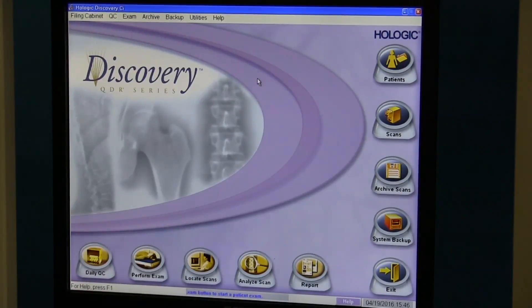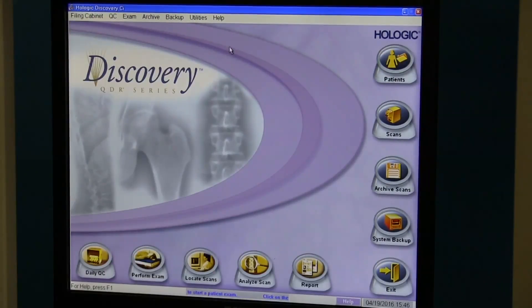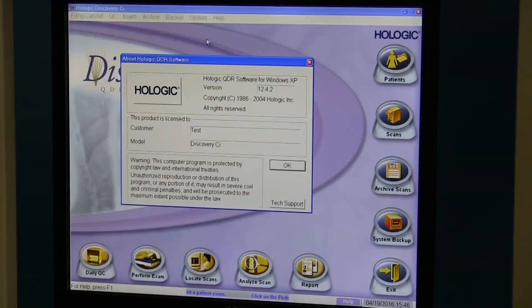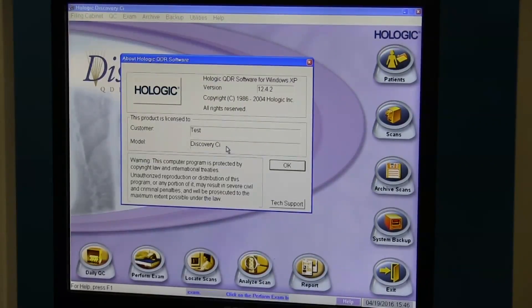In addition to the serial tag on the back of the system, you can also find the model by going up to Help and down to About QDR, and this will tell you the Discovery CI model for this system.